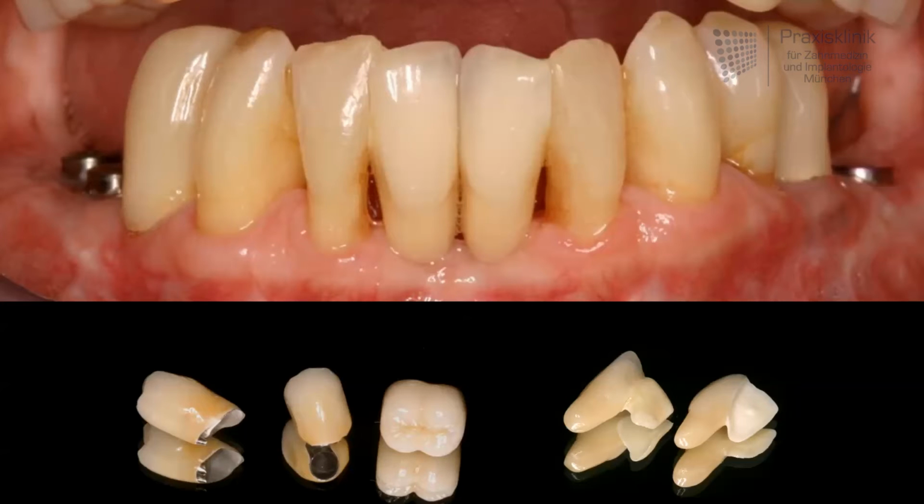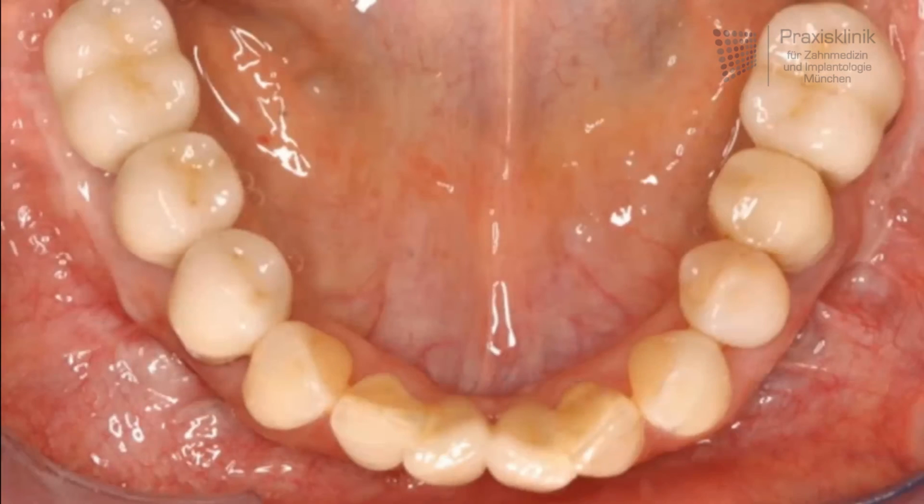So we replace the first incisors in the lower jaw by all ceramic cantilever bridges, which are bonded to the neighboring teeth. And in the lower jaw, it's visible that we replace missing tooth substance with metal ceramic crowns in the posterior region. And after uncovering of the implants, we can go on and have the implant-supported prosthesis as well. So these are also 2 metal ceramic crowns on the right side and 1 metal ceramic crown on the left side.